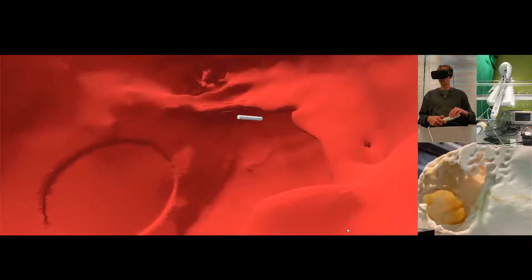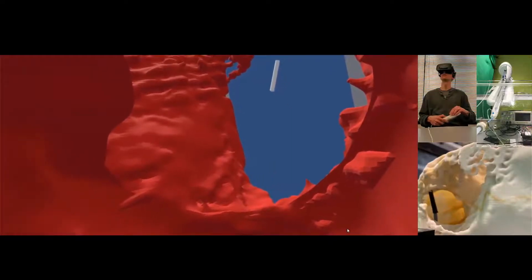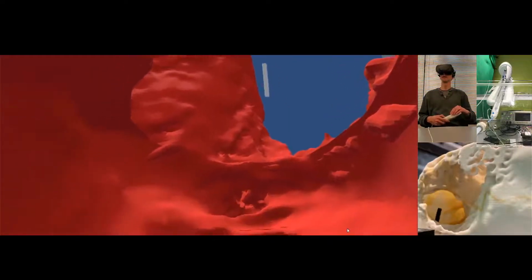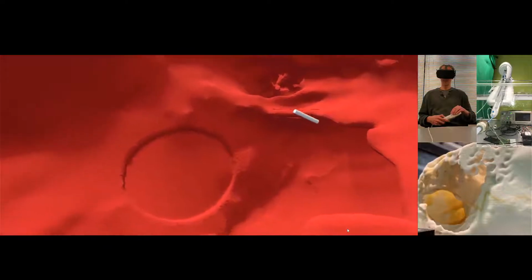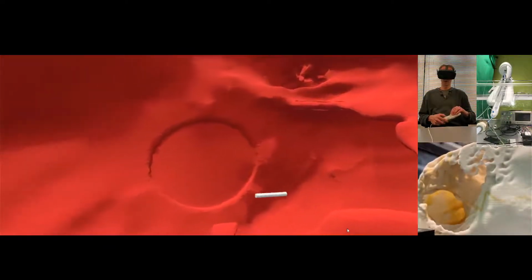I'm going to advance the catheter using the robotic control, remote robotic control, and I'm heading in toward the tricuspid valve and out into the RV outflow tract, as you can see. And now I'm going to pull the catheter back down. And if I wanted to, I could go over through the fossa ovalis.